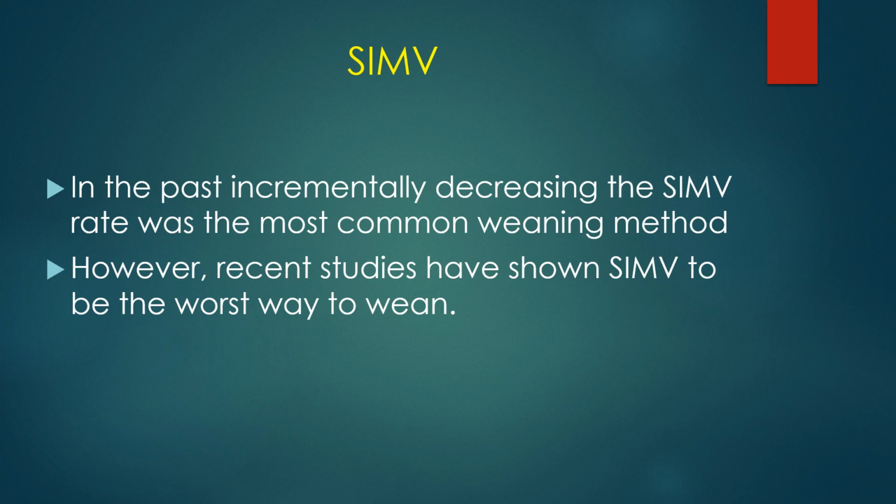And that sounded perfectly reasonable. You're returning the work of breathing from the ventilator back to the patient in a staged manner. And so we did that all over the world. Everywhere where they used ventilators, patients were weaned off the ventilator using SIMV. It made a lot of sense. Just thinking about it, that makes sense.